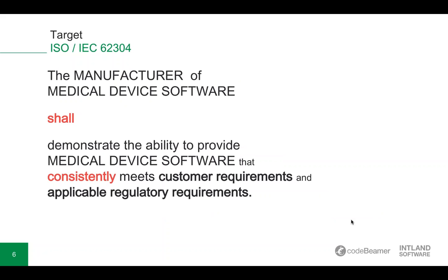So let's go to the target of the ISO IEC, and I pointed out some things here as well. The main target is that the manufacturer of the medical device software shall demonstrate the ability to write medical device software that, and this is the important one, consistently meets customer requirements and the applicable regulatory requirements, which can be quite a huge amount.